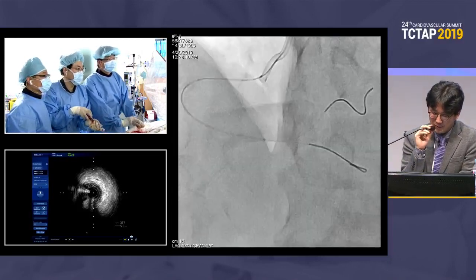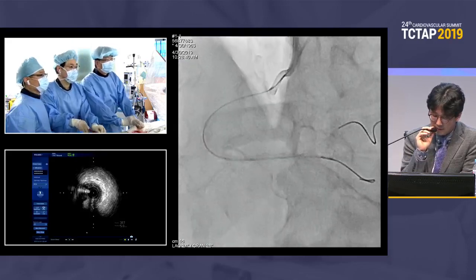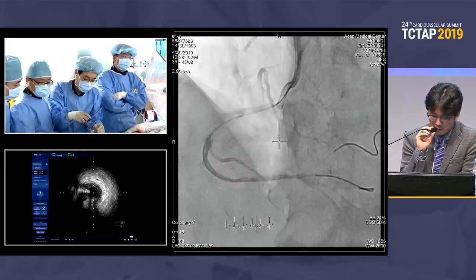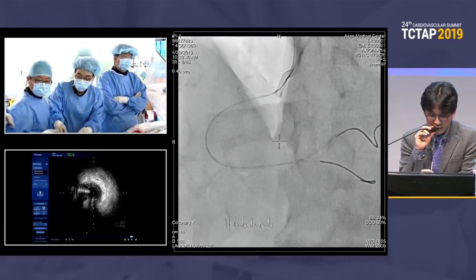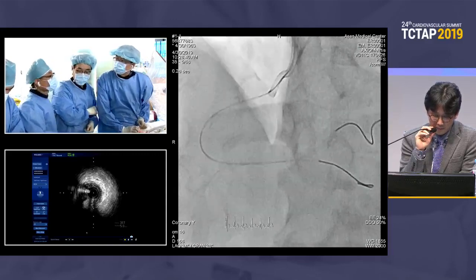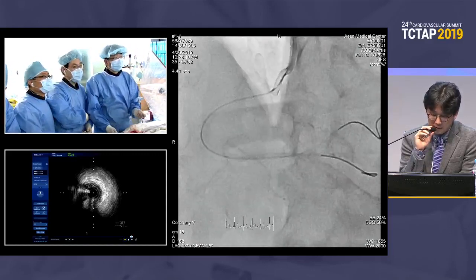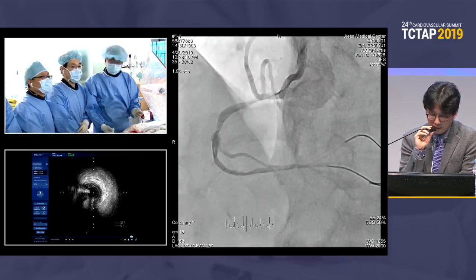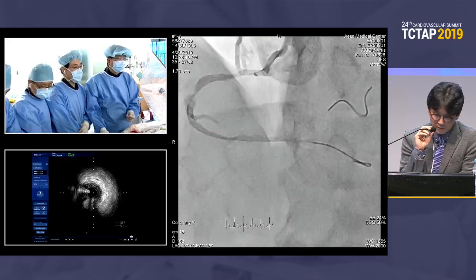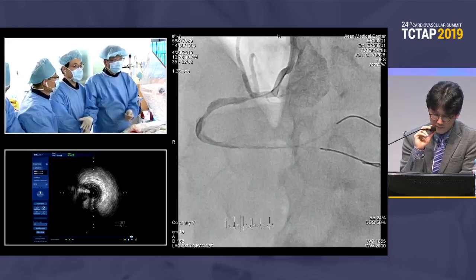So I think there will be different thoughts and different strategies for this patient, because, strictly speaking, there is no absolutely clear landing zone at the distal. So that's one problem. So which one is the best for the landing zone? Another problem is that if you want to stent it, maybe you have to cover the hematoma. And I recommend the landing zone at the ostium of the PDA. Because distal to the ostium of the PDA, the vessel is too small.